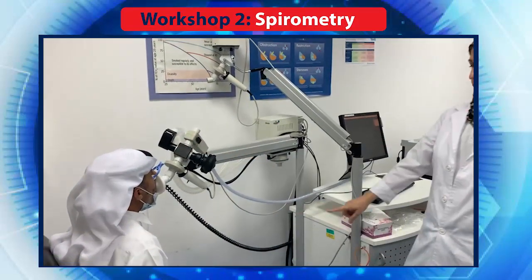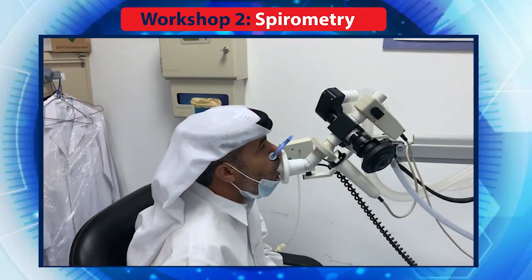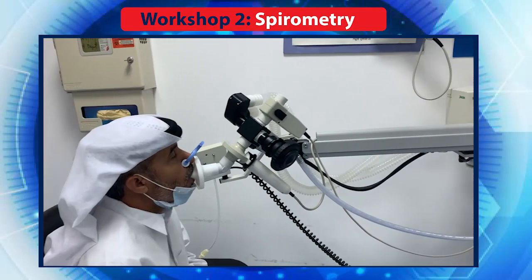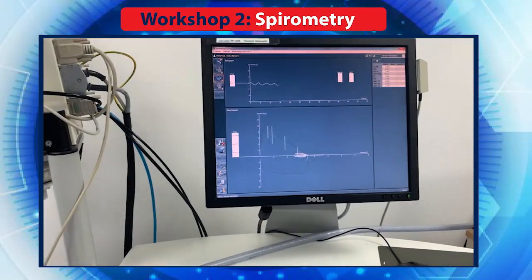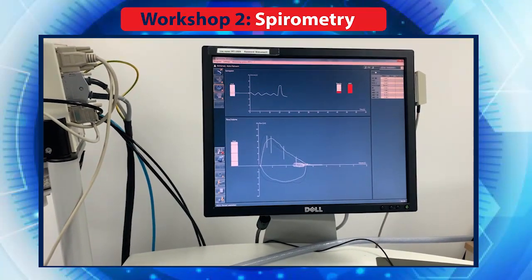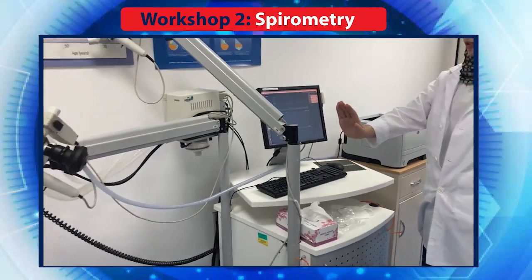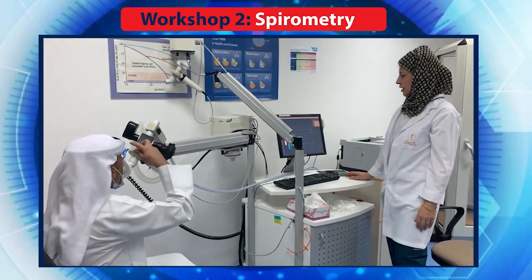Nose up, normal breathing. Normal breathing, good. 3 times at least, normal breathing, good. Now big breath, big, and push. Go, go, go, go, go. Big breath, big, big, big. Okay, excellent. Stop. Okay, good. Just stop. Relax. You can remove. Catch your breath.